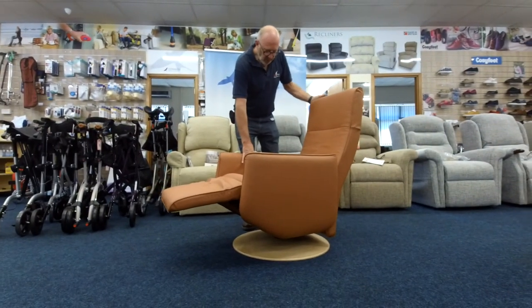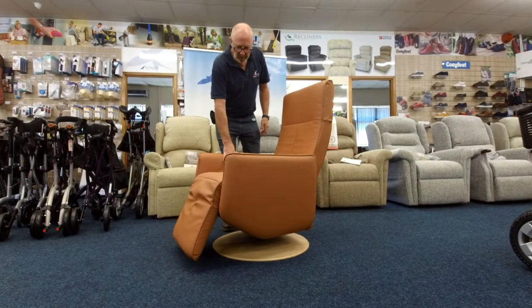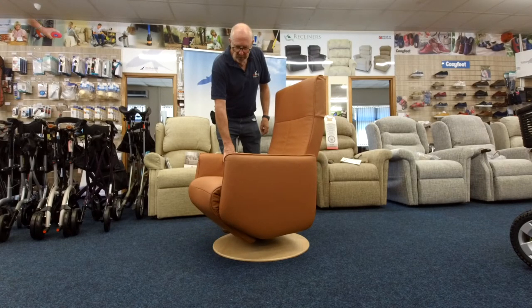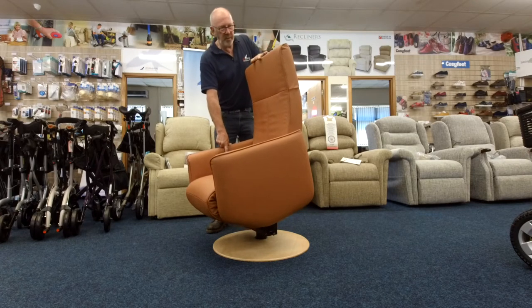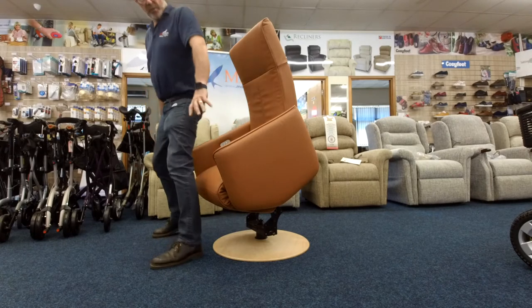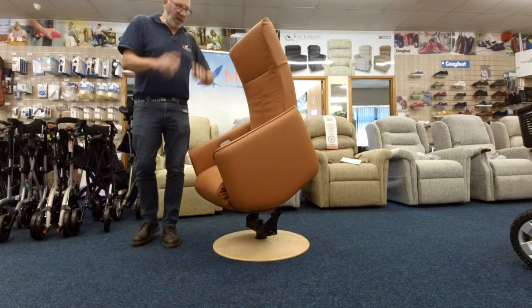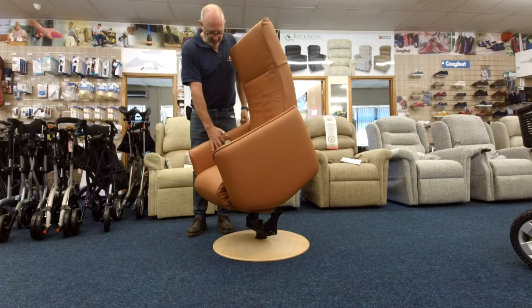And then up it comes — and bingo, you've got a riser recliner chair! That's the unique bit. What we've done with these chairs is that when you get them, it doesn't matter where you've got the chair facing — as soon as you start to rise, the chair locks itself into position. So if you press to rise, it doesn't just swivel around and have you end up in a heap in the corner. That actually locks it.